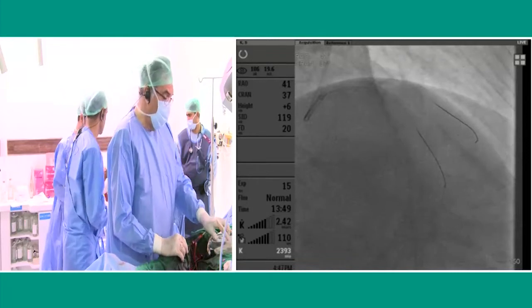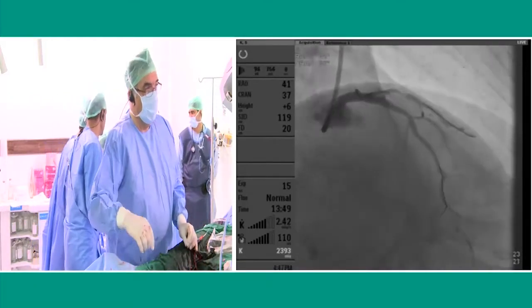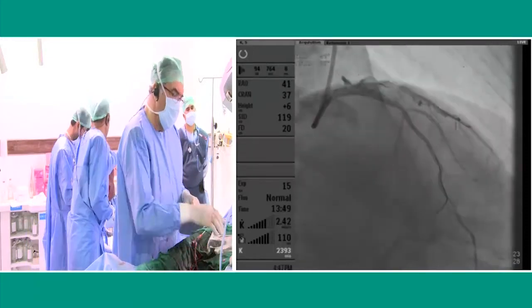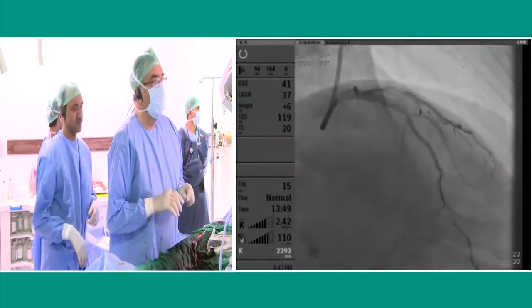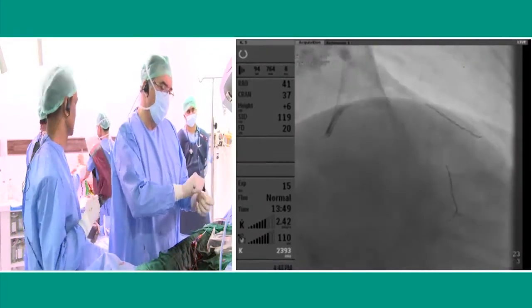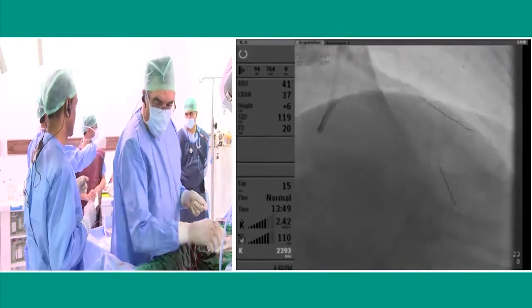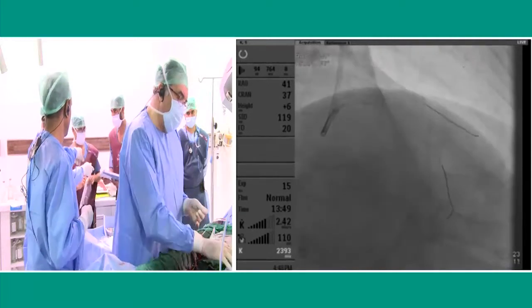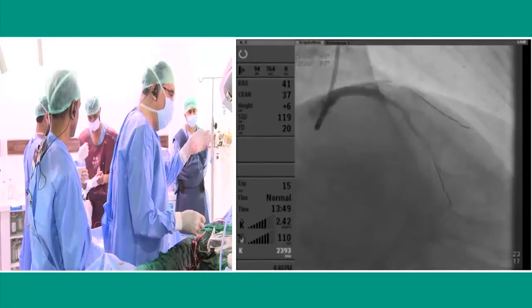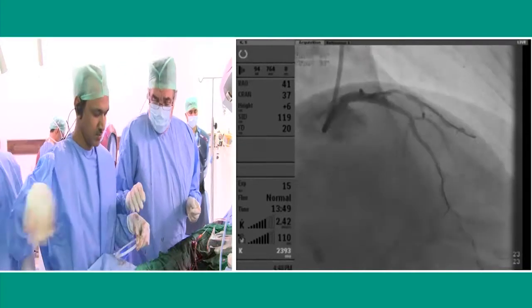Is there any study when you use a small size stent and you overinflate up to 4.5, about polymer peel off or polymer crack down? Is there any information about that? No, for the 4.5, with the last generation DES, a 3.5 can be opened at 4.5. Over 5 millimeters, I cannot tell you, but 4.5, there is no problem.